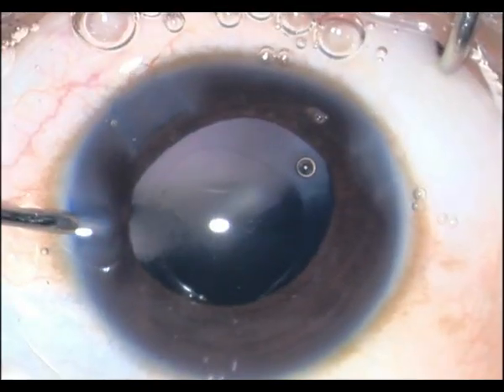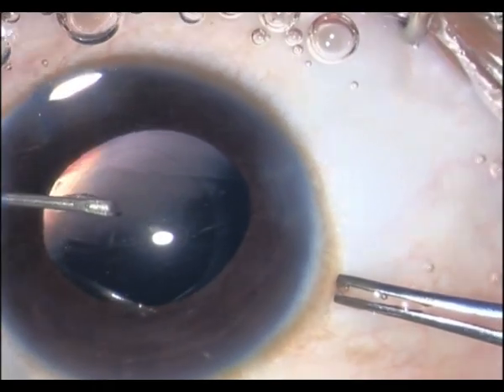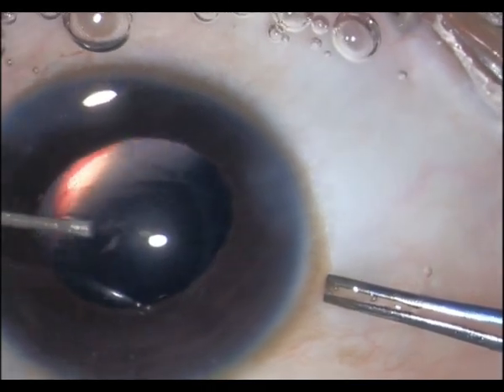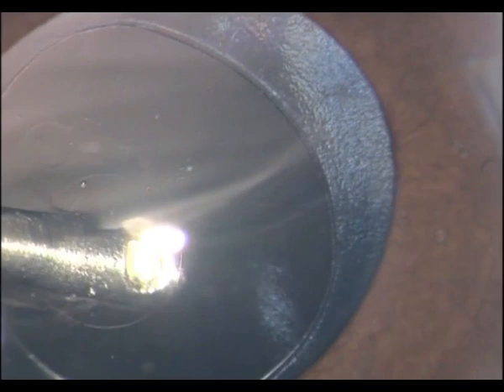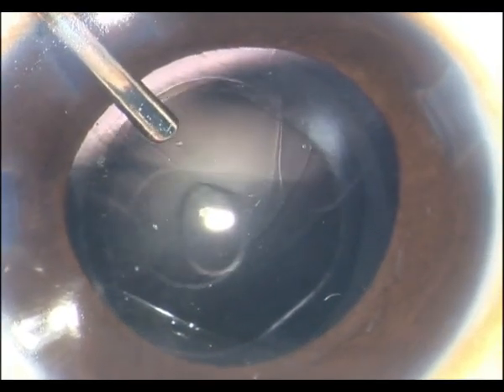Once I have removed all the cortex, I once again place HPMC and I am now initiating my posterior capsulotomy. This is a different way in which I am doing — I have changed my technique nowadays. I usually go with a 30-gauge or 26-gauge needle, puncture the capsule, inject some viscoelastic and separate the posterior capsule from the anterior hyaloid. I have not done that step here. I have just initiated with the cystitome and then, taking my pediatric rhexis forceps, I am performing the posterior capsular rhexis, which is only about three millimeters. I now do a larger posterior rhexis. I have also done the anterior vitrectomy, and you can see some of the viscoelastic going back where the vitrectomy has been done — this has to be and will be removed.